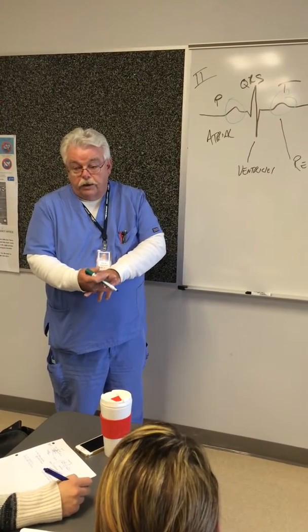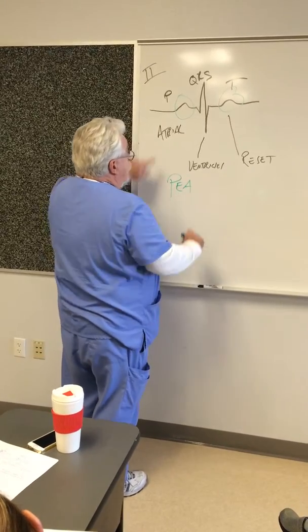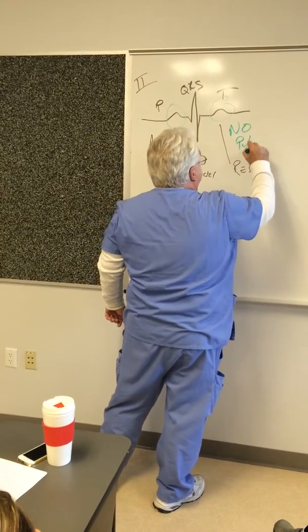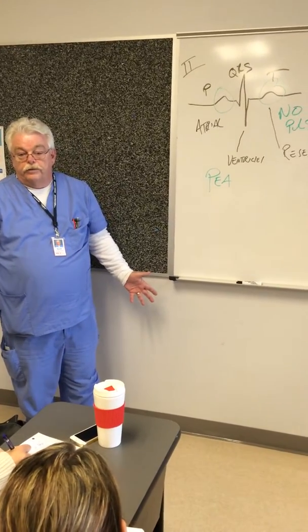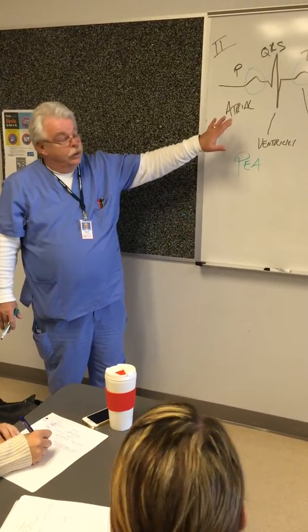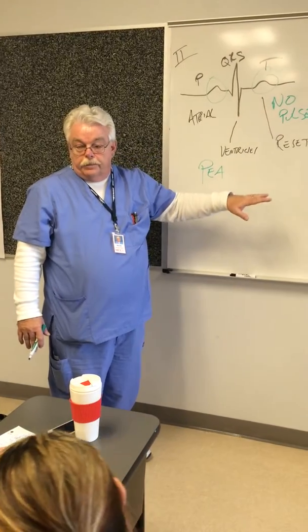That's pulseless electrical activity. It's called PEA. Pulseless electrical activity. It's gonna look just like this. On a test, the only way they can do this is put that on the strip on the test. It says no pulse, or pulseless. If you get that one wrong, you need to resign from nursing school. That's the gimme. So that's normal, PQRST. All right, any questions on that?